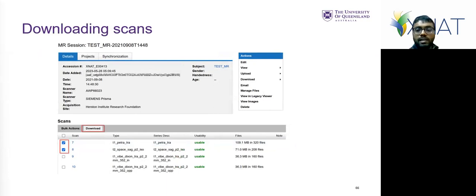Okay, so will alias and secrets continue to work after AF user and password access is revoked? That is a good question, actually. I think technically no, but that might be something we'll have to correct due to the way the authentication works. If your user account in XNAT is disabled, your alias token will not work.